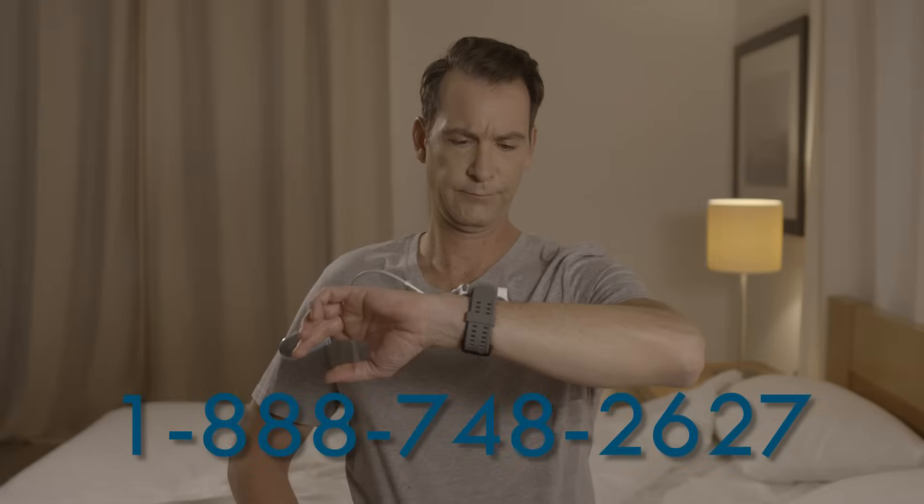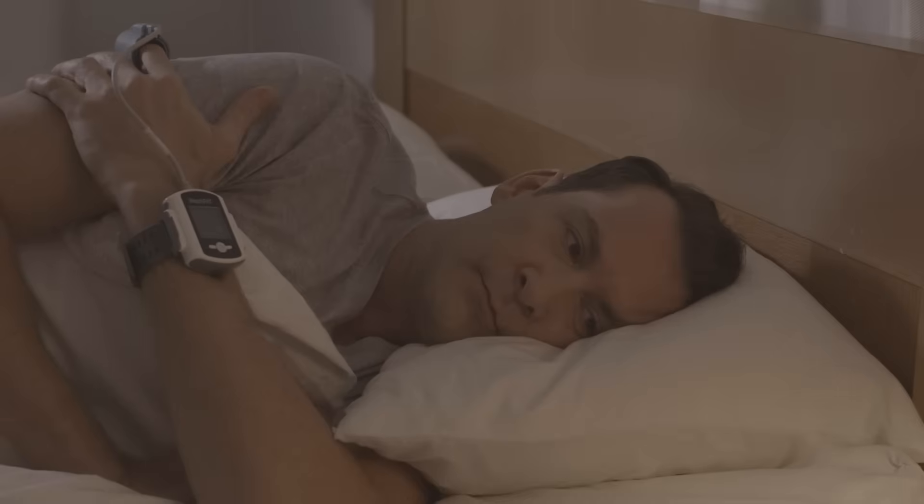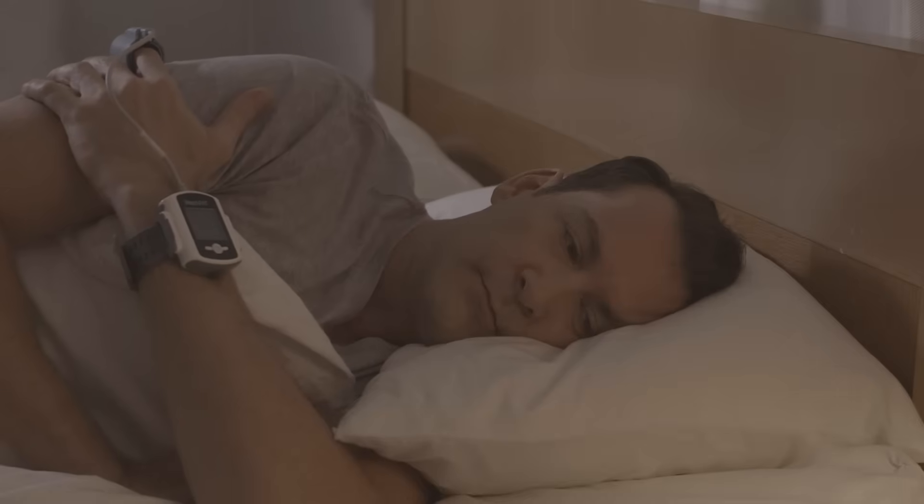If there is a problem, you will see a test aborted message. In that case, note the error code and call the help desk. WatchPad is now working properly, and it's time to go to sleep. Good night.